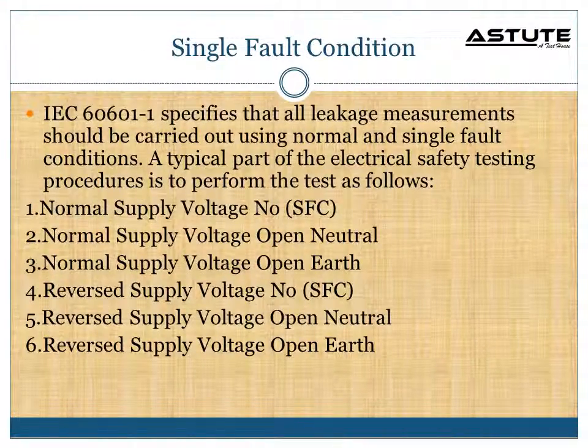To maintain a medical device's high level of protection during its operational life, a number of design features are taken into account to maintain the integrity of the device's electrical safety. This is done by introducing conditions that could occur under normal use, that is, reversed mains supply or voltage on signal input or output terminals, also called SIP or SOP, and conditions that can occur under a single fault condition, that is, SFC.